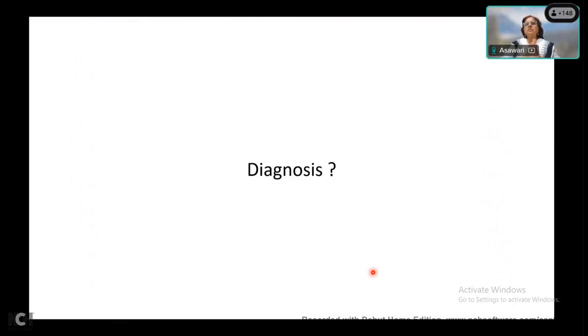Okay. So now what is your diagnosis? Suha, just summarize all the points and tell me the diagnosis. Ma'am, encapsulated lesion with cells arranged in microfollicles with necrosis, capsular invasion, then angioinvasion. So it's not very well captured, this is like the thyroid. Probably it is entirely replacing the thyroid. But yes, we do see many foci of invasion. Okay, and there is angioinvasion.